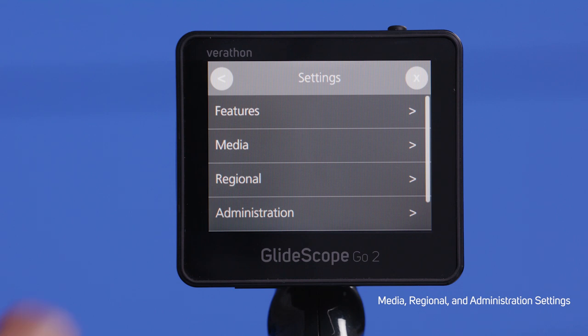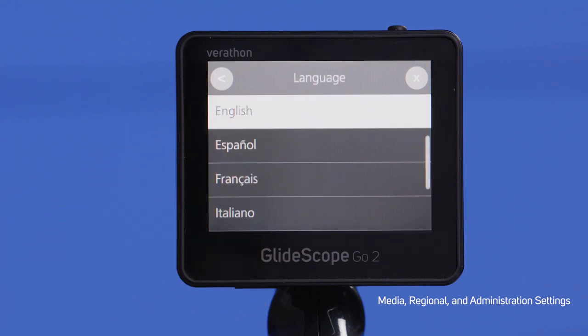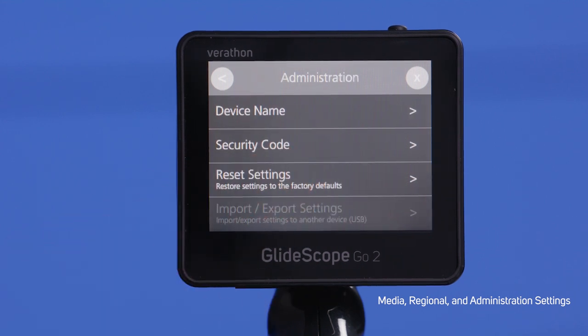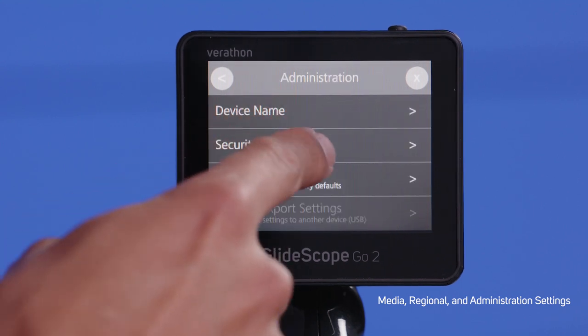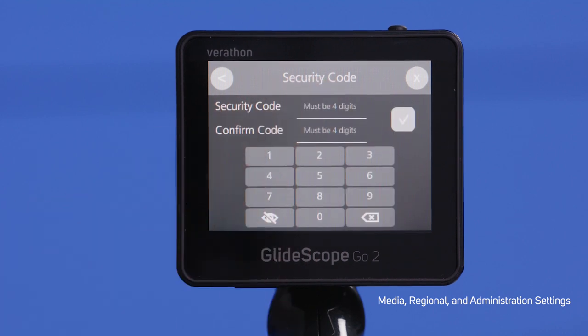Under Settings, click Regional. This will allow you to customize your preferred language and choose the date and time. Under Settings, click Administration. You can click on the device name to customize your Go 2 monitor name. If you click Security Code, you can enable and create a security code to access the settings later.